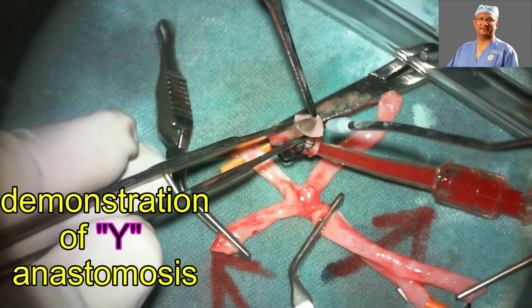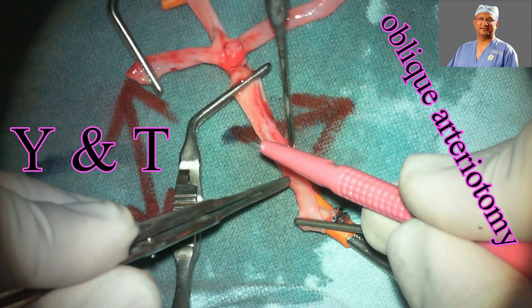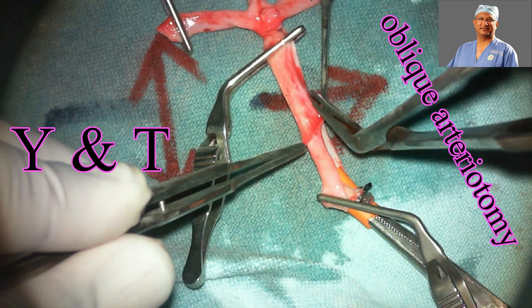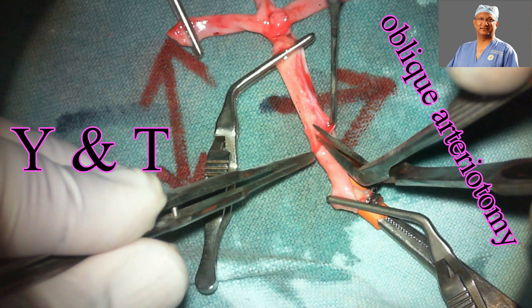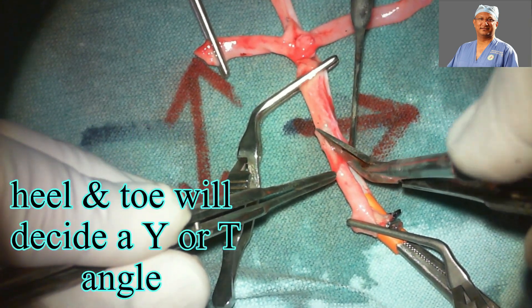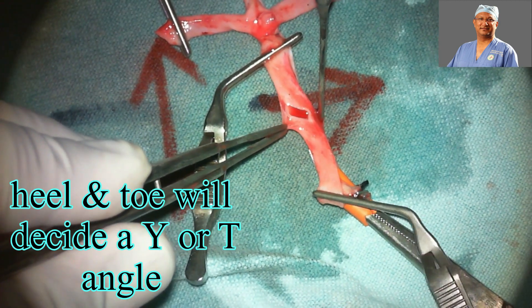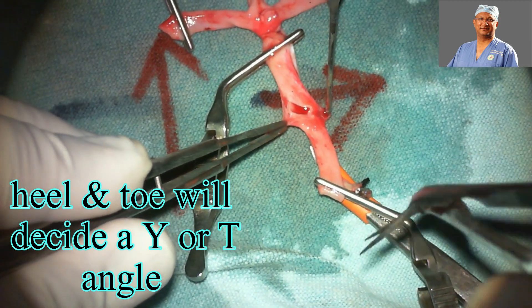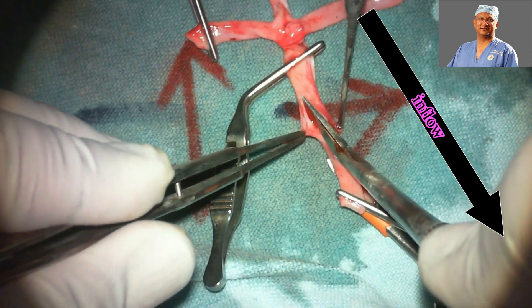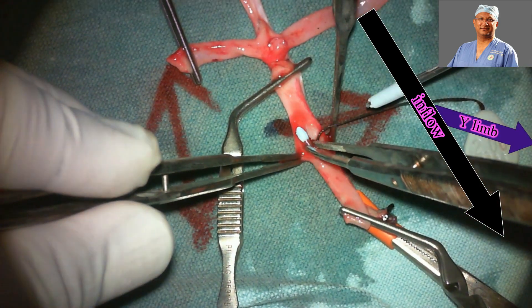For a Y anastomosis, either on the mammary artery or on the vein, the arteriotomy should be a bit oblique. Make an arteriotomy with the Potts scissors, engage one blade in the arteriotomy, lift it up, and then make a single cut so that you don't injure the posterior aspect of the artery. For a Y, you need a longer arteriotomy on the vein or the mammary artery, as against a T anastomosis where the arteriotomy on the artery or vein and the exit artery remains the same.